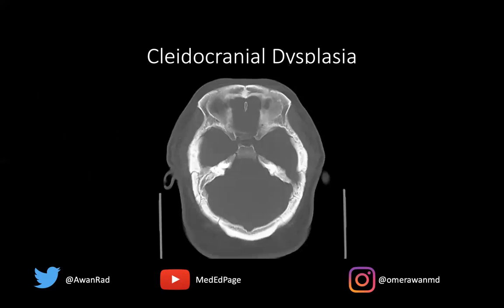I want to show a CT image on bone windows of the cranium and calvarium. Notice we have intrasutural bone here — this is a young person where we have Wormian bones, intrasutural bone that shouldn't normally be here. This is what Wormian bones look like on a CT examination, an axial CT on bone windows. Just another image to go along with the frontal view of the chest for this great case of cleidocranial dysplasia, which of course is an autosomal dominant inheritance mode.